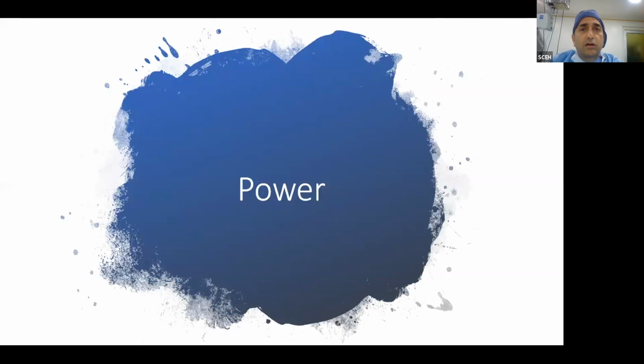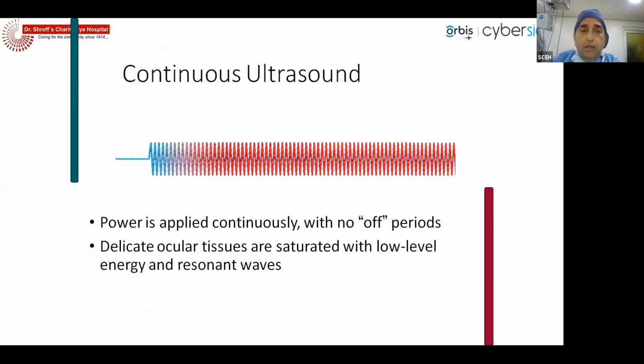The last modulator is power. Power in a conventional phaco is a jackhammer effect. It goes back and forth at an ultrasonic speed. So actually, power is a repelling force. Once the piece has broken, it repels and throws pieces away, as you would have seen in a jackhammer or a drill, where the pieces and the stones fly all over the place. That's what a conventional phaco, which is a longitudinal phaco, does. It's a back and forth movement of the tip, which throws pieces away.